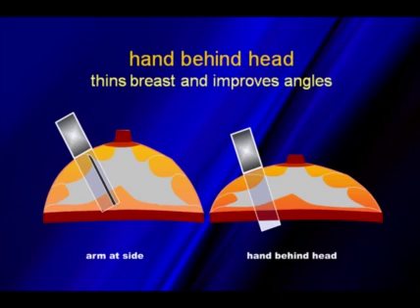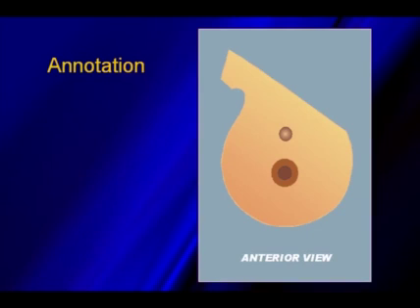Kind of a good rule to remember is that if you're using your high frequency linear array transducer and you're trying to image something at about 5 centimeters in depth, you're pushing that transducer too far, and you may need to go to a lower frequency transducer to be able to see lesions better in the deep field.